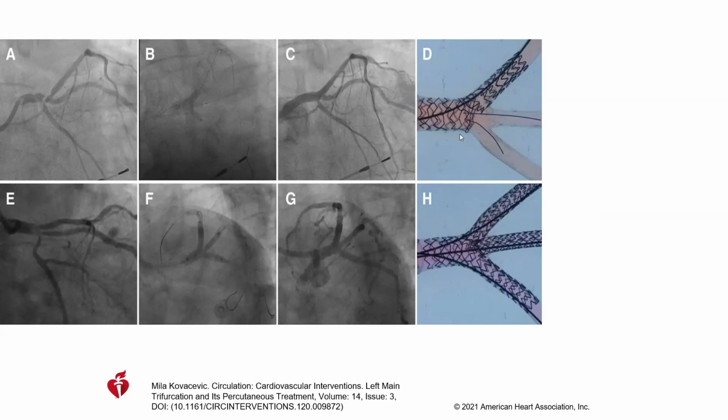So after good POT and distal strut rewiring close to the carina, they were able to position sequentially 2 TAP stents. Imagine, have you done DK crush here into the ramus instead of TAP? Imagine DK crush will go all the way here and you'll have 3 layers of metal covering here, the circumflex. Very difficult to recross and stent the circumflex.